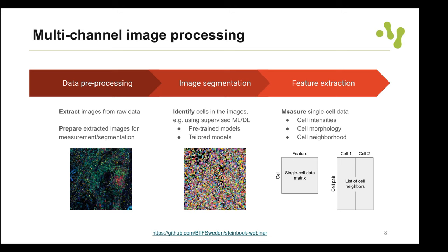The masks were regenerated. We can now apply them to the images and extract features from our cells. One of the first features to extract is the channel intensity values per cell — these are aggregated so all pixels corresponding to the same cell are averaged. The command is 'steinbock measure intensities'.